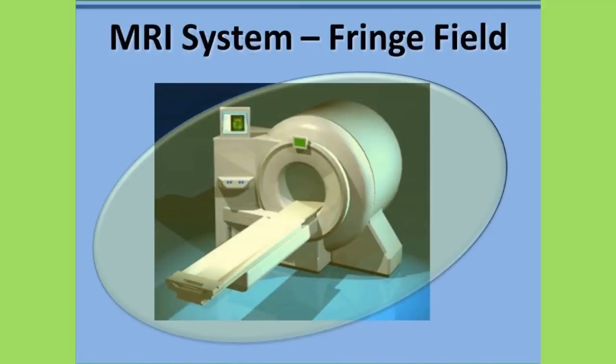This figure shows a stylized depiction of the fringe field of an MR system. The fringe field is represented by the lightly colored area. Note that the fringe field extends in a three-dimensional manner from the scanner in all directions, including above and below the MR system. Therefore, ferromagnetic objects may be attracted in a variety of different situations related to where the fringe field is located relative to the scanner.